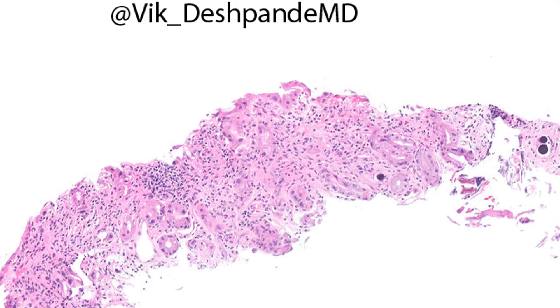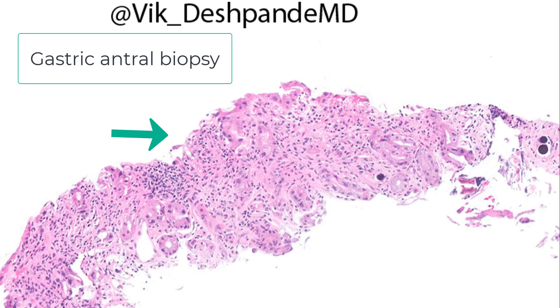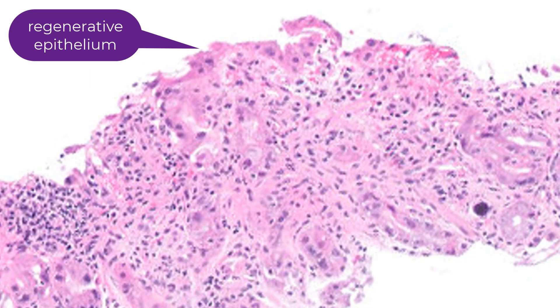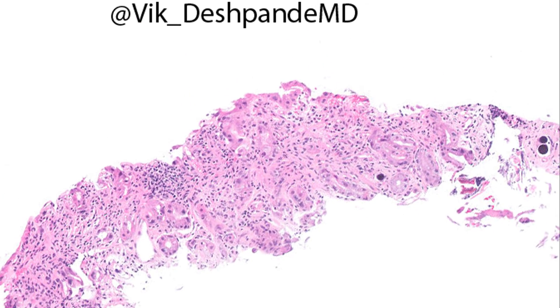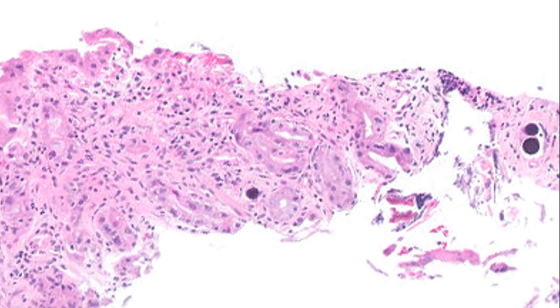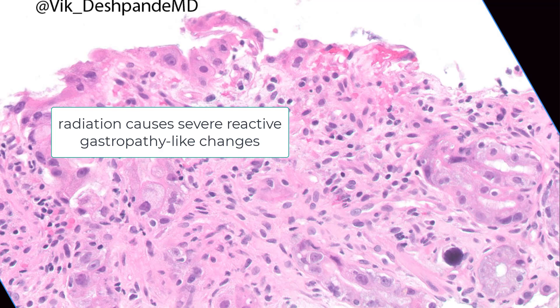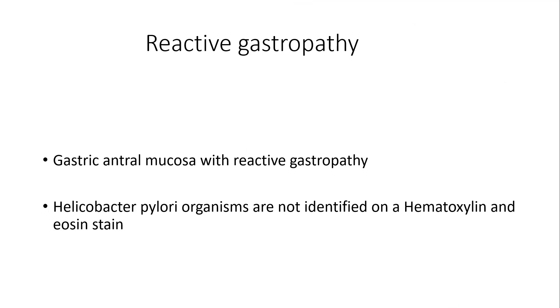This is something you will not see every day. This is the gastric antrum, and you can see a lot of the epithelium is lost. The epithelium looks a little scary, but I can assure you this is not dysplasia — this is regenerative surface epithelium. What's the underlying etiology? Look at those little dark spots: these are Y90 spherules deposited here inadvertently during an embolization procedure in the liver. These emit radiation, and hence you can see the most severe reactive gastropathy-like changes in the stomach when they make their way into it.